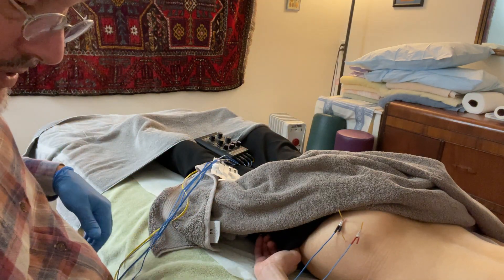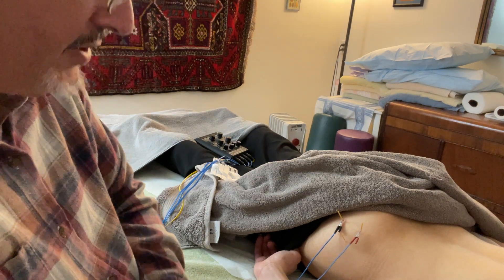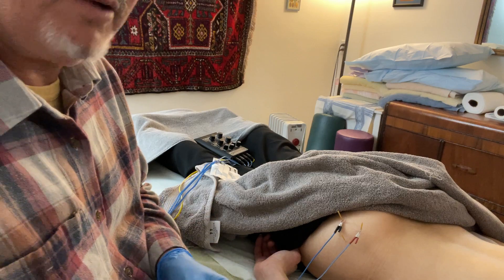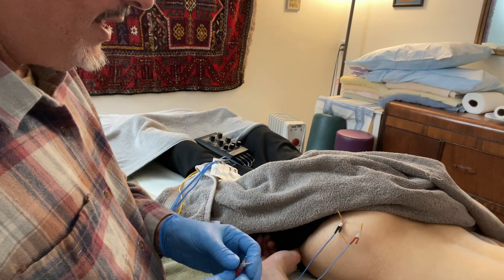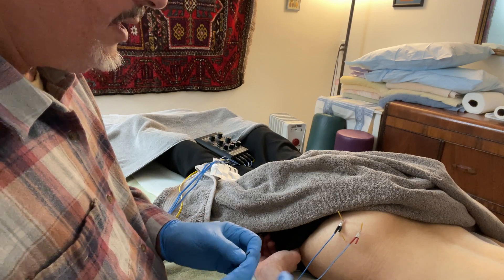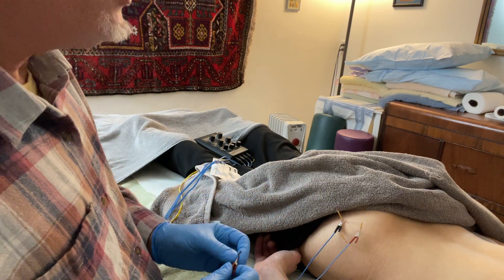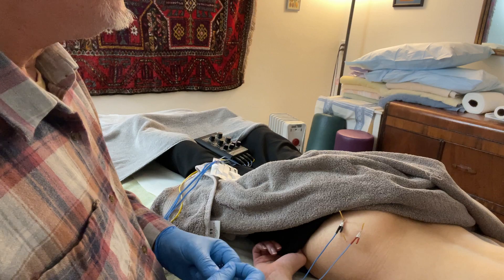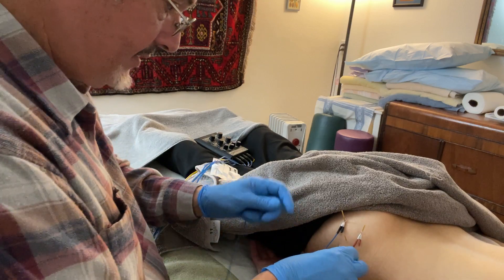Electrical stim is really great for people that like it. I especially like to do it in a case like this where she's got a really strong muscle — she's an athlete — and she's got this chronic issue and it's really dense tissue. So you're breaking up the adhesions, and scientifically you're helping the collagen fibers repair when you do the electrical stim. That's exactly what you're doing.